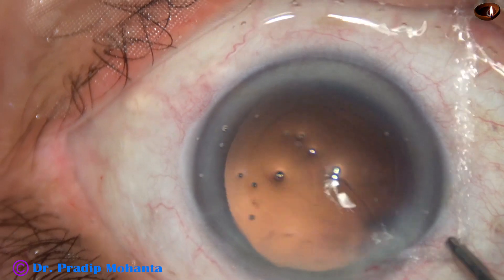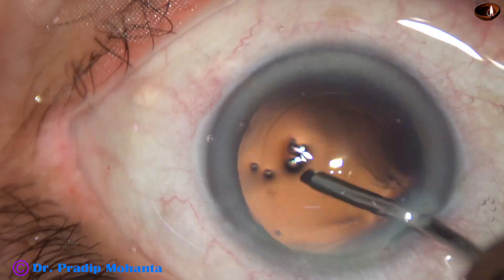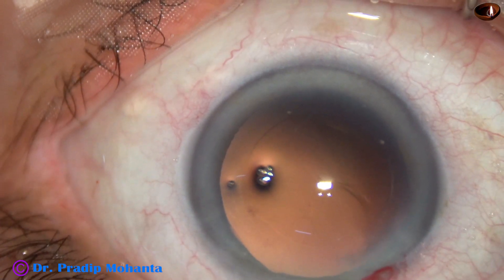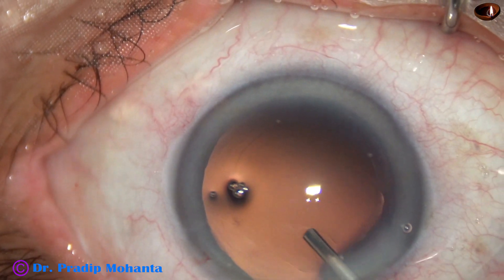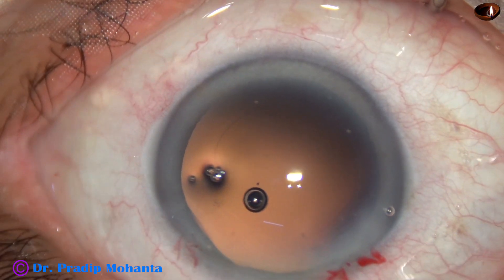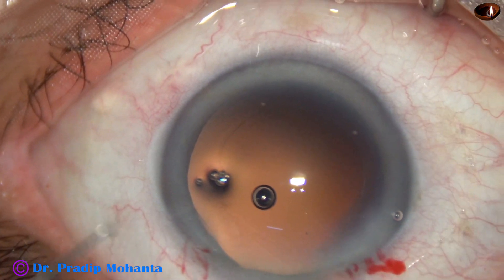This is hydropolish — meaning we are using the irrigating jet of BSS to polish the posterior capsule. In this case, we are going to use a Hoya intraocular lens which is in a pre-loaded system.